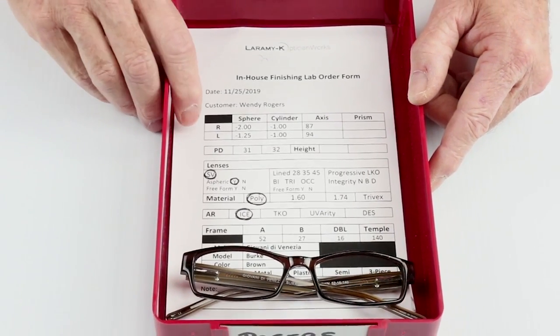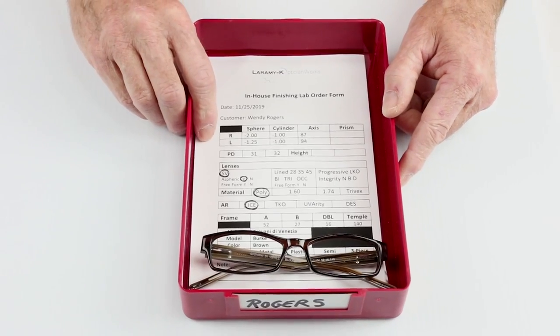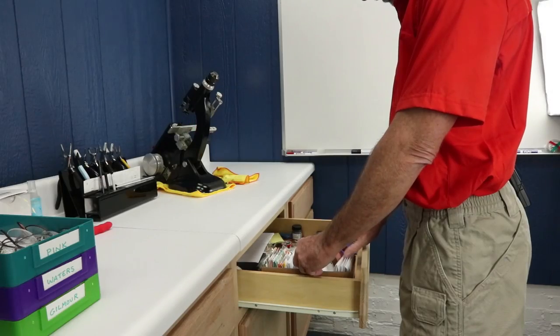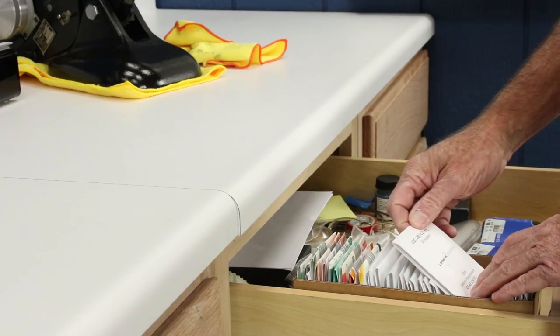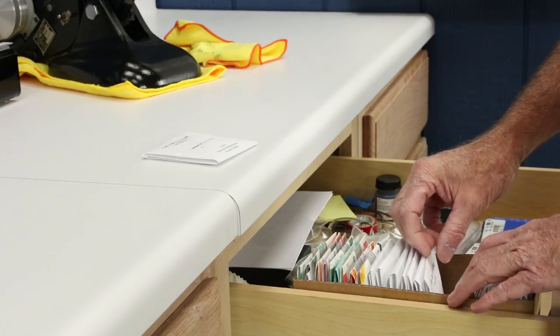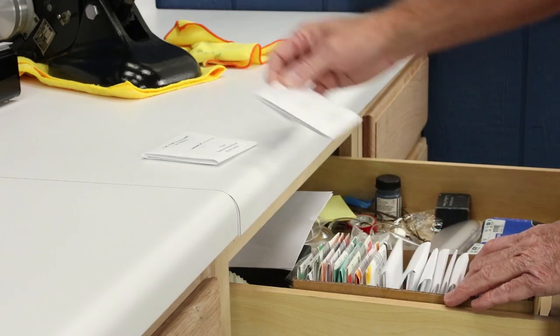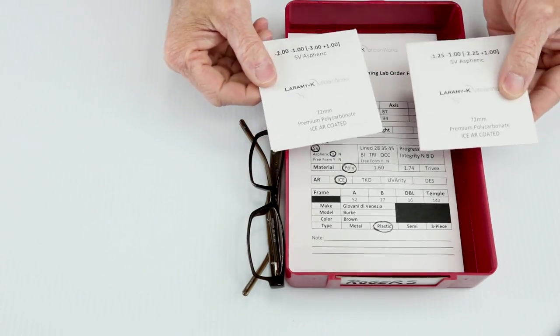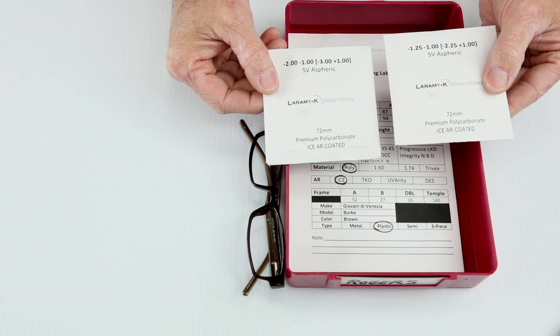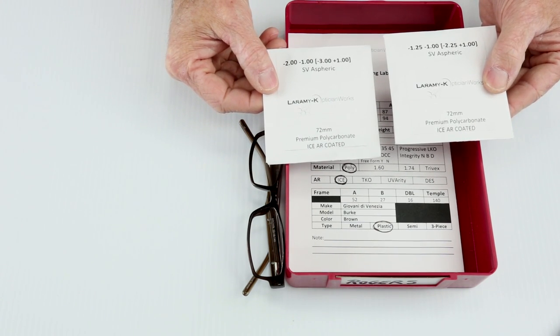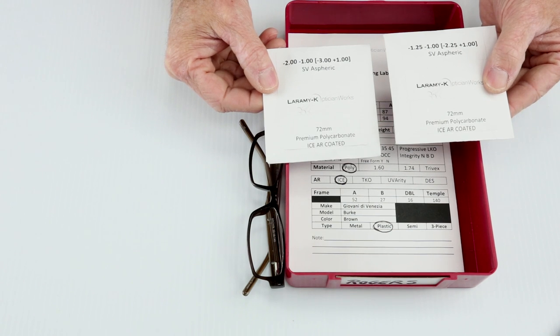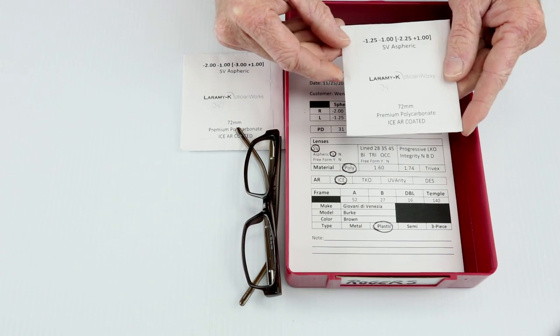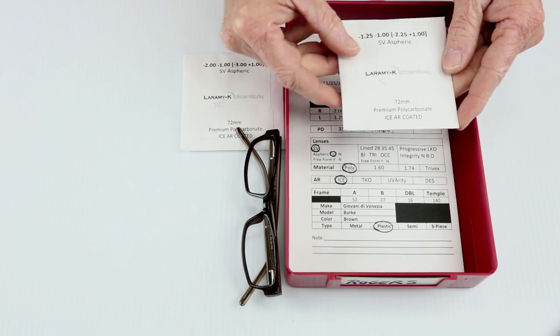The very first thing you're going to do is make sure that those lenses are actually in stock. So let's go over to the lens stock drawer. Make sure we got them. Yes, we do. Fantastic. All right, so we have our lenses here. I've got my minus two, minus one, single vision, aspheric, premium polycarbonate with the ICE AR coated for my right, and I've got my minus 1.25, minus one for my left.